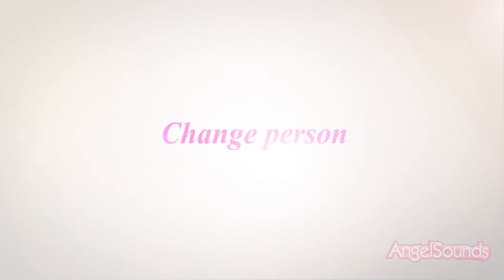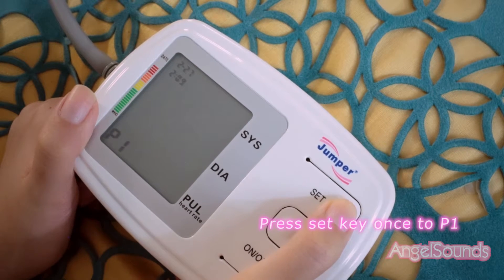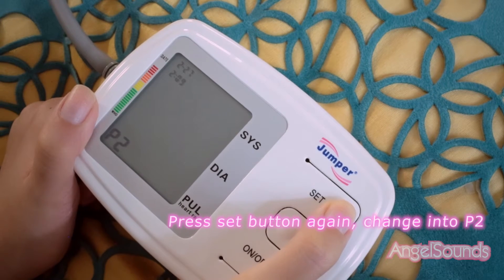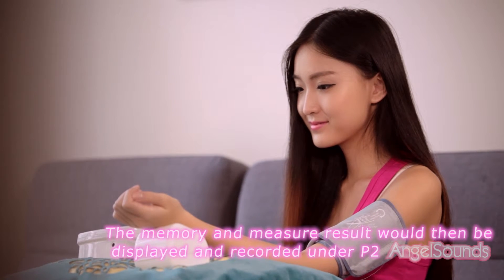To change person profile, press the set key once to switch to P1. Press the set button again to change to P2. The memory and measurement results will then be displayed and recorded under P2.